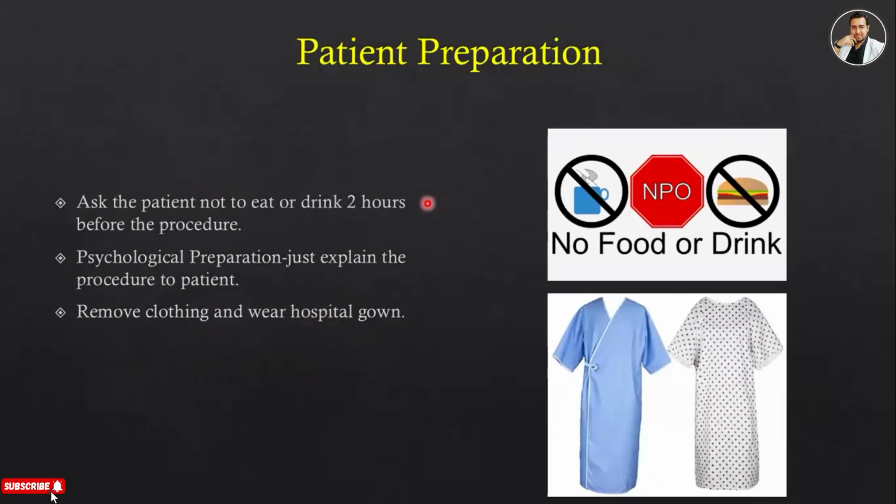And the preparation needed for this procedure. Ask the patient not to eat or drink 2 hours before the procedure. So the patient needs to fast for 2 hours before the procedure, and psychological preparation, just explain the procedure to the patient.